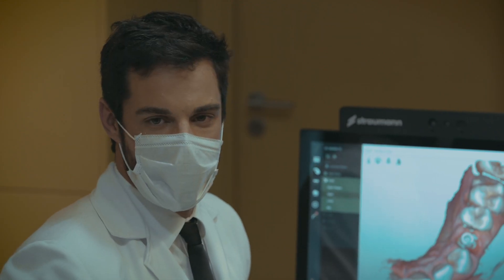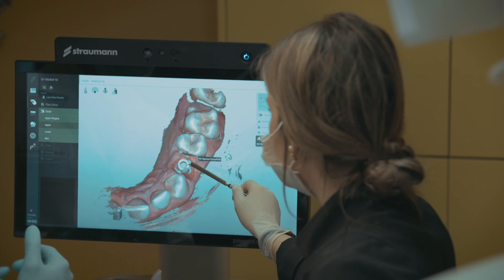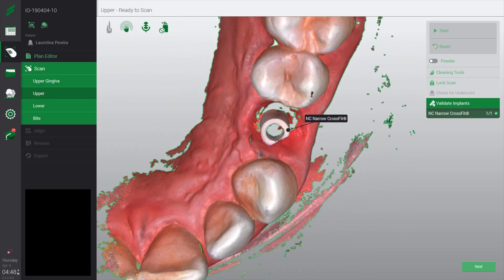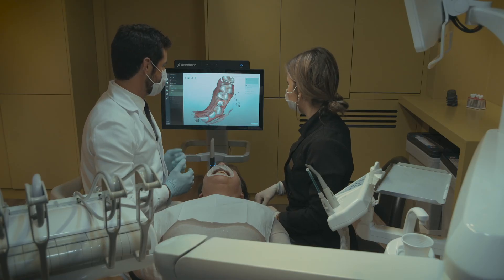Now it's time to validate our implant. We go to the tool and you can see that we selected the NC on the scan body — narrow platform. Then we go to the next step. And because we have an auto-cleaning tool, artifacts like the tongue and the lips will disappear automatically.